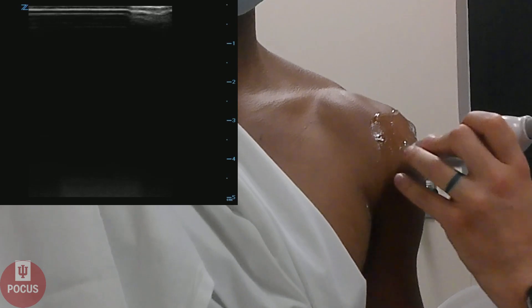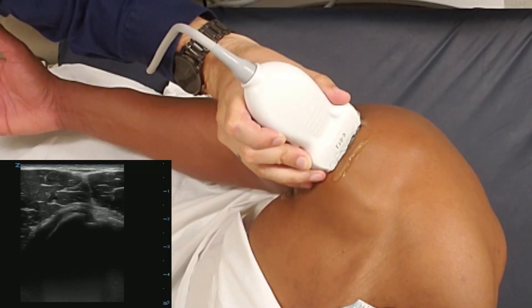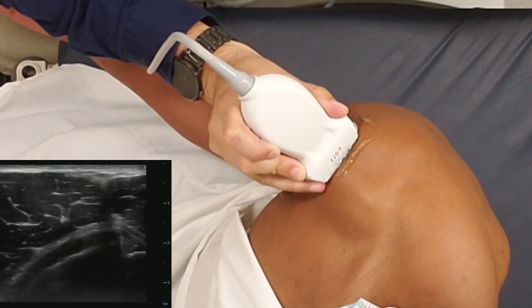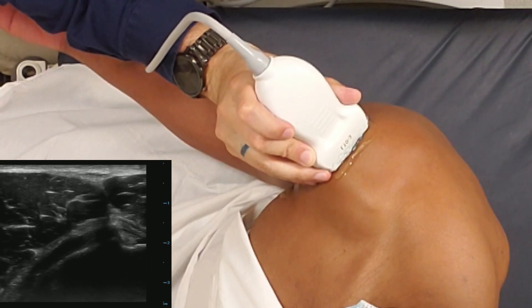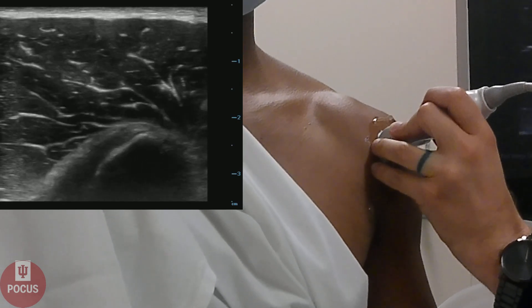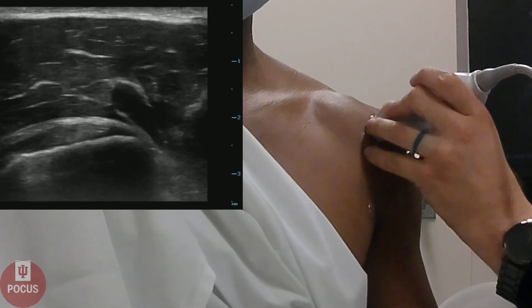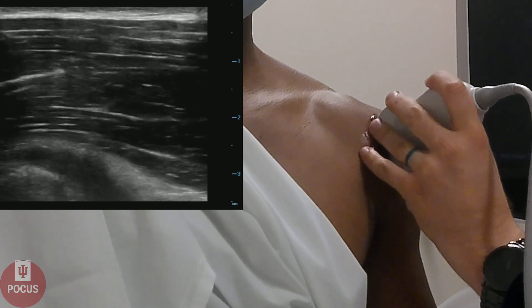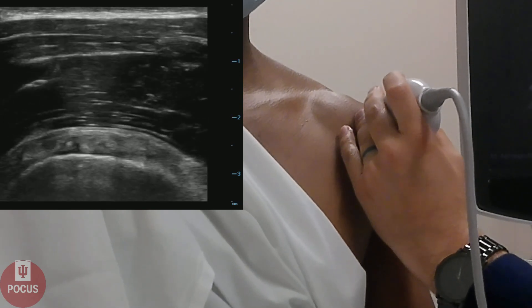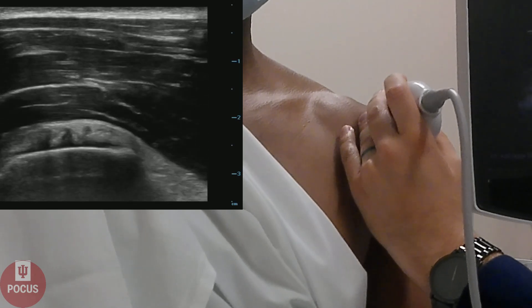Next, we'll go back up to the home base of the biceps tendon, and we'll have our patient externally rotate his arm, which will bring the subscapularis rotator cuff tendon into better view. You can see on this image it looks kind of like a bird's beak — it's a triangular structure. We fan and slide back and forth through the tendon, then always rotate 90 degrees so we can view the tendon in short axis as well. We're looking for any large tears that could be a sign of pathology within the tendon.